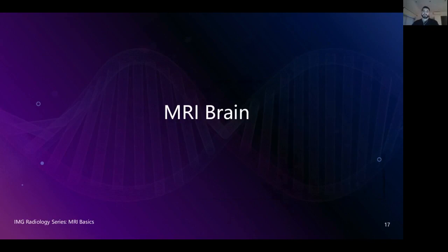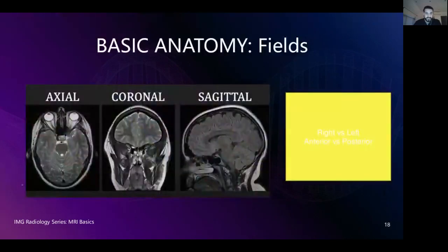So now we're going to look at some examples of the MRI brain. So remember, when we're looking at imaging, there's different planes that we look at imaging in. We've got your axial, your coronal, and your sagittal. And that's very basic to understand when you're looking at any kind of image. It's very important to understand what plane you're looking at things in. And also to understand that the patient's left may be your right, and vice versa.